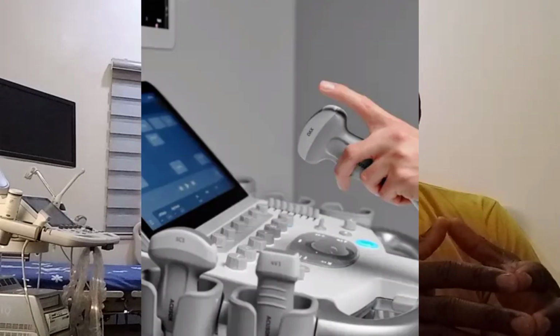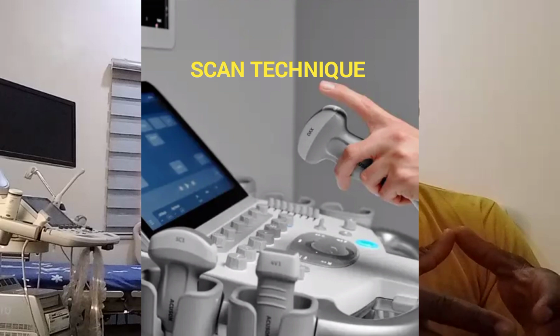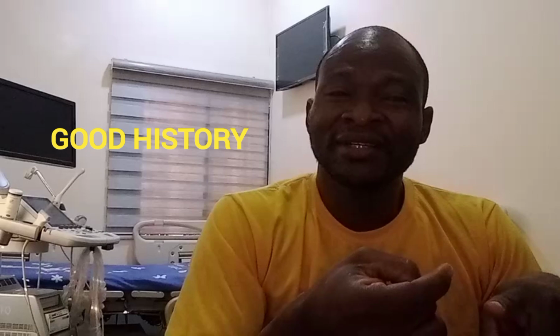So what are the scanning techniques that we usually would do in a gynecologic study? Now, there are several techniques for evaluating the female pelvis. These include taking good history and correlating it with laboratory tests. It's very important you take good history. You do transabdominal sonography.